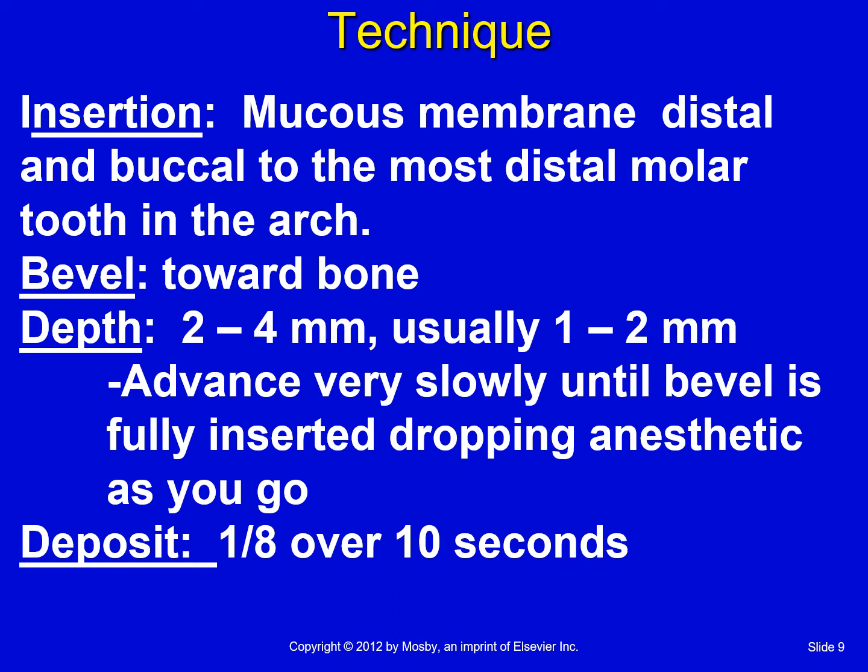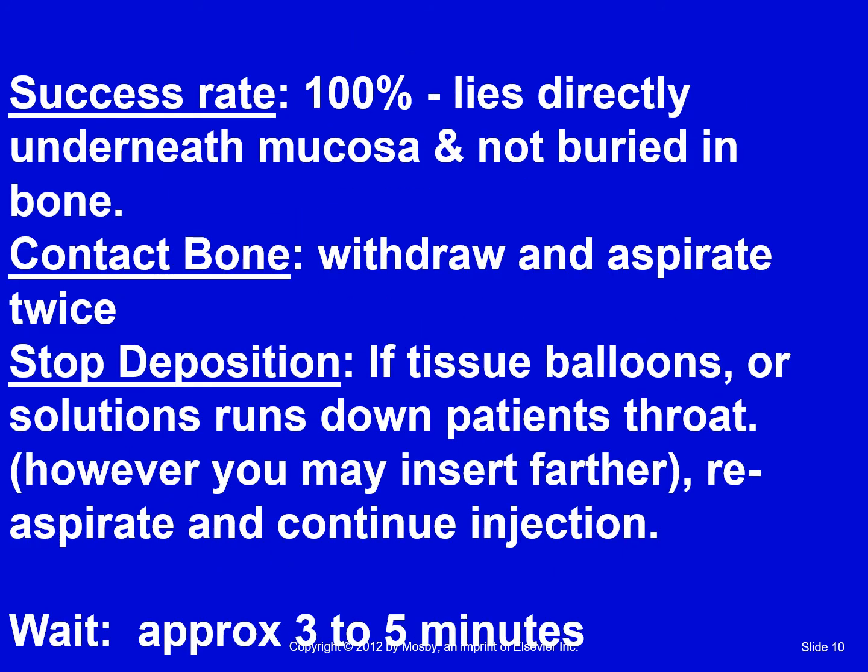And if you have leakage, it's because the bevel is not completely into that tissue. And then you'd need to come out and maybe move to the right or the left so you can go in just a little bit further. But you deposit 1/8 of a cartridge, which is a stopper full, over 10 seconds. The success rate is super high on this.